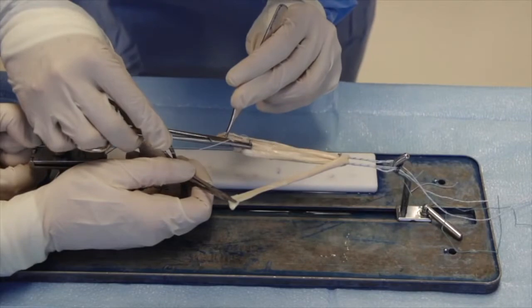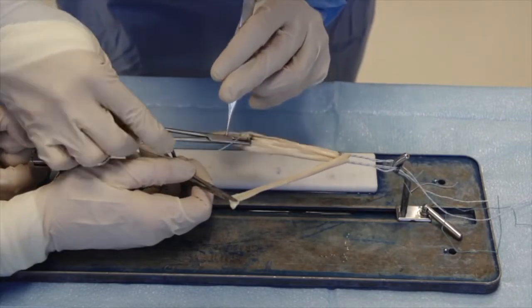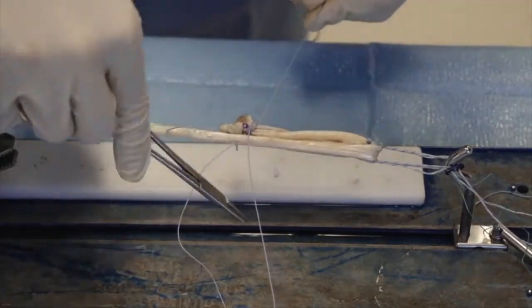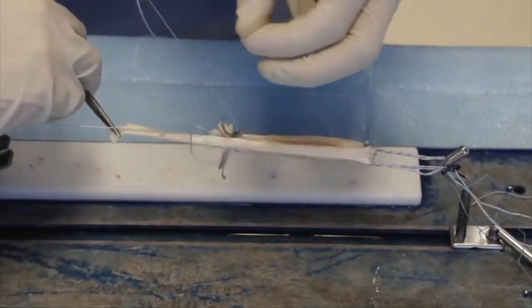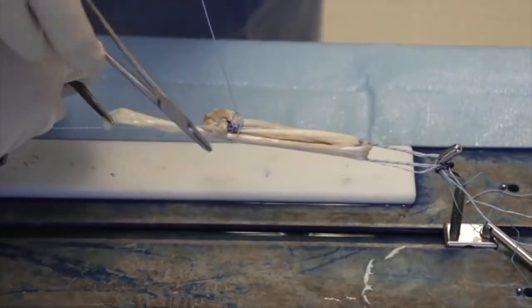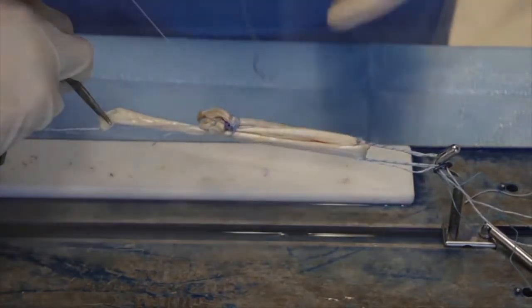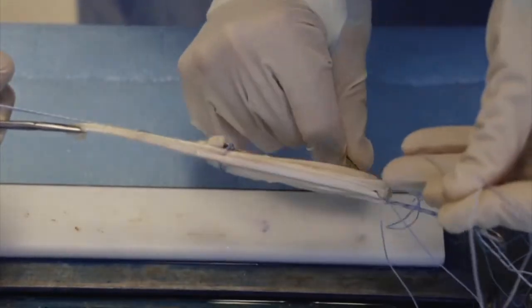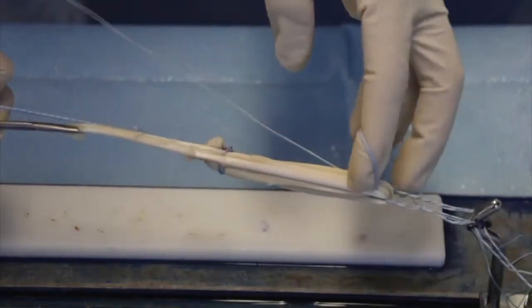A needle is passed at the end of the three strand graft through all five strands. The five strand graft is then whip stitched with fiber loop from proximal to distal.